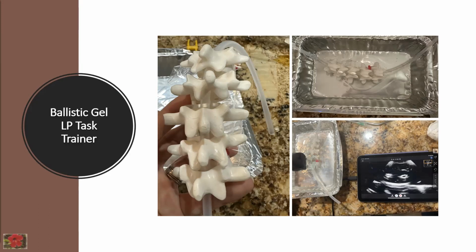But yes, I have found that sometimes it's too hot, and not only is it too hot for some of the things I want to put in there, but things may either fall to the bottom of the mold or rise to the top. So if you're trying to make it sit more in the middle, if you let it cool a little bit, you can better dictate where that inside material will lay. That way you have a little bit more control over where your vessels will be.